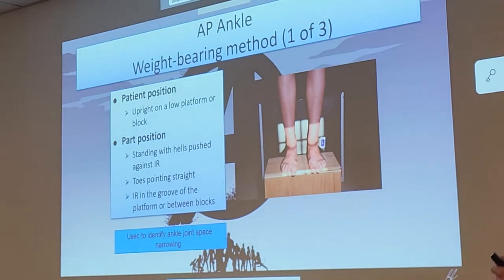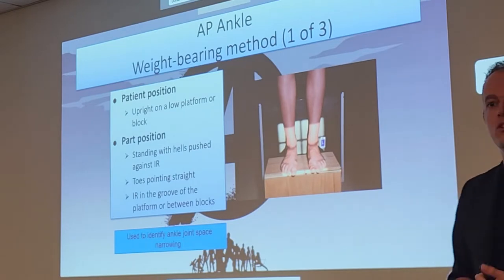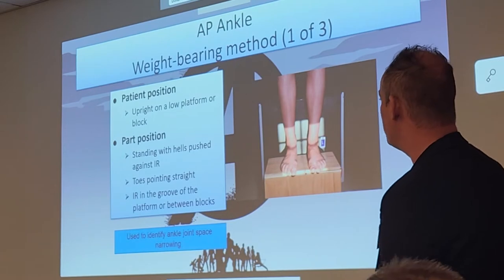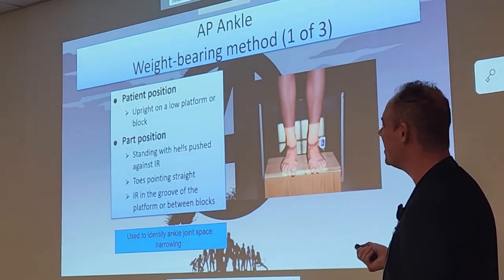Now the weight-bearing AP ankle. This should look familiar — we just did one of these on the feet. Same concept: patient will be upright on a low-platform block. Heels pushed against the IR to reduce OID. Toes should be pointed nice and straight. We want to identify ankle joint space narrowing.